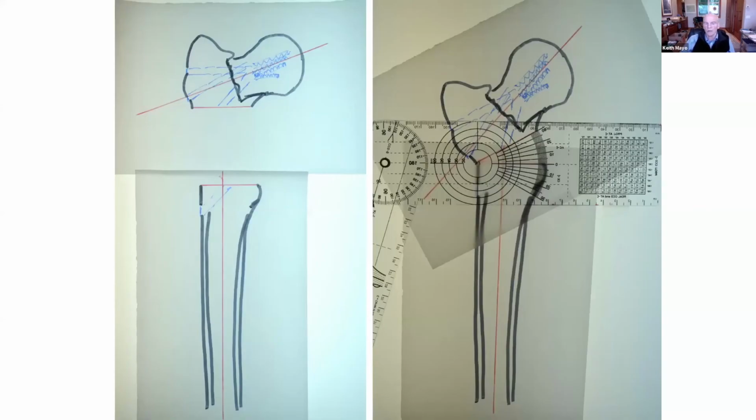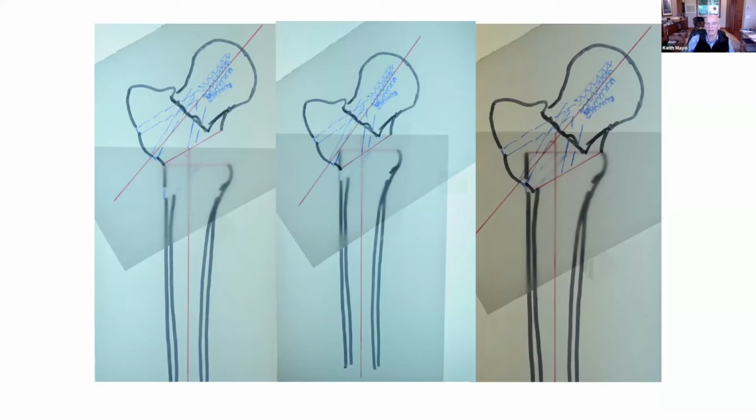The easiest way to plan it is to have two segments. So if we go back to our transverse intertrochanteric osteotomy, then we have a proximal segment and a distal segment. And then we have a goniometer based, digital or otherwise, opening wedge. And then we can go to essentially an infinite variety of different options.